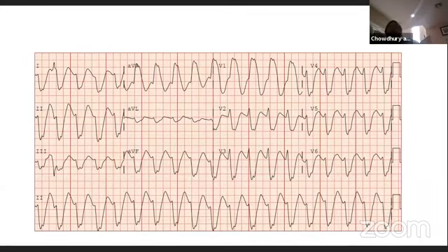And one of the notorious combinations in my experience over the years is an end-stage renal disease patient, AFib, bowel ischemia. When they go for bowel ischemia and dissection, the acidosis becomes so profound, and the anesthesia docs call us with this EKG for a STEMI, and we said, yes, you're right.